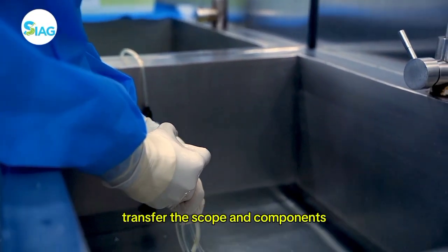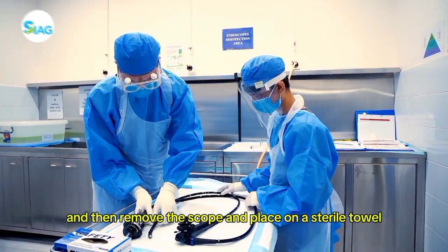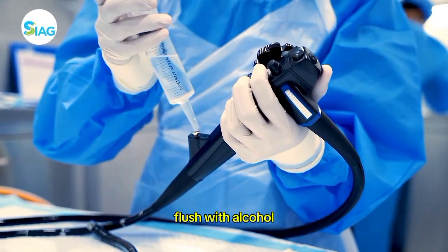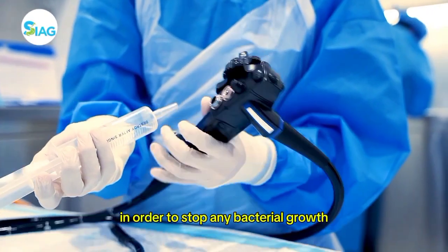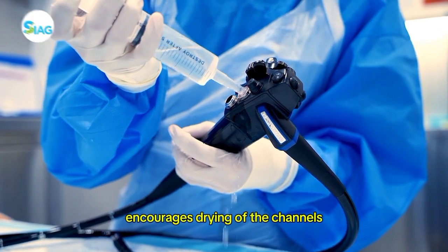Transfer the scope and components into a container of clean water, then remove the scope and place it on a sterile towel. Dry with a lint-free cloth and flush with alcohol. In order to stop any bacterial growth, flushing the scope with alcohol encourages drying of the channels.